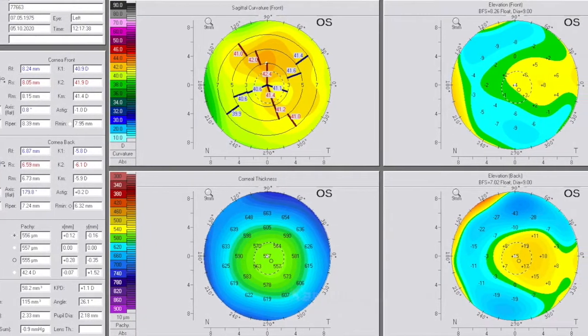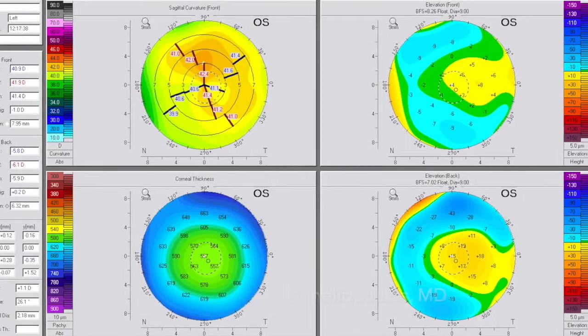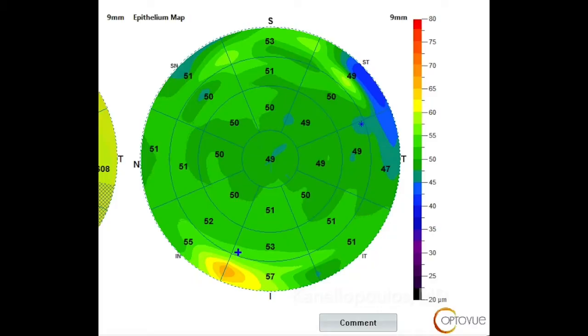This is a new technique. This is a 40-something-year-old lady that has about two diopters of hyperopia, and these are preoperative pentachems. These are epithelial maps.